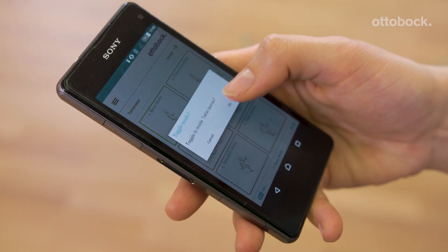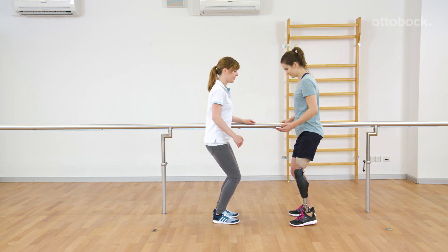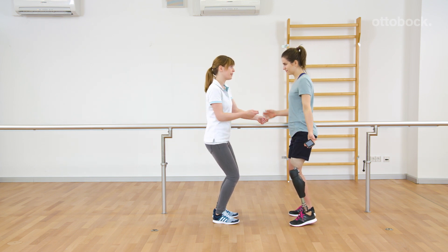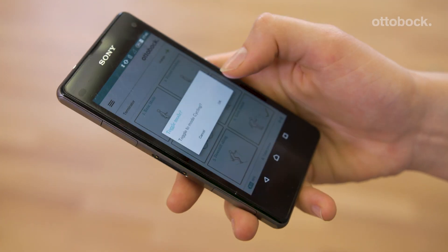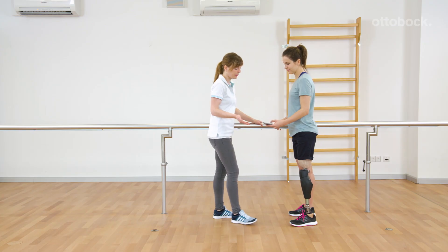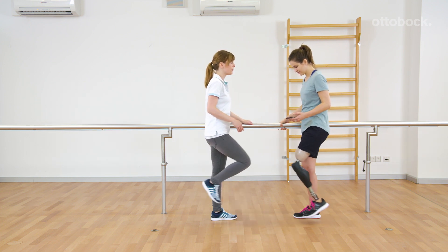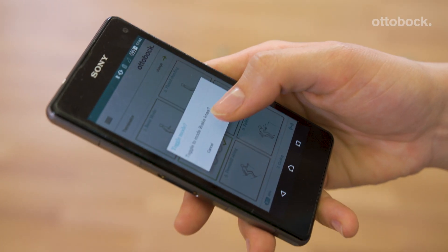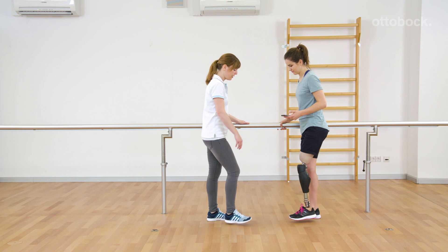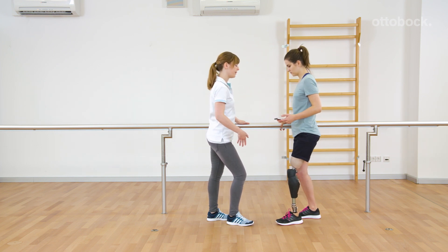For example, table tennis. Switching to cycling mode. Switching to brake friction knee mode. When loading the prosthesis, the knee joint blocks in the flexion direction.